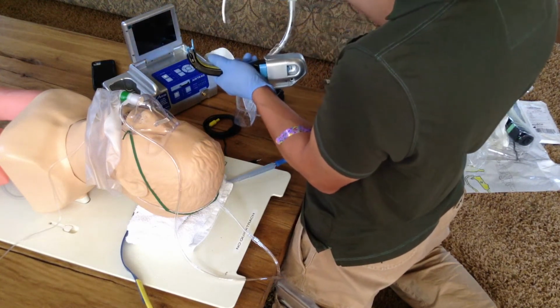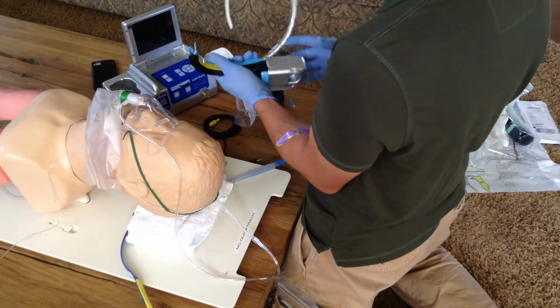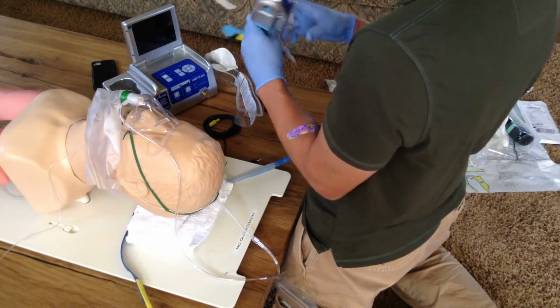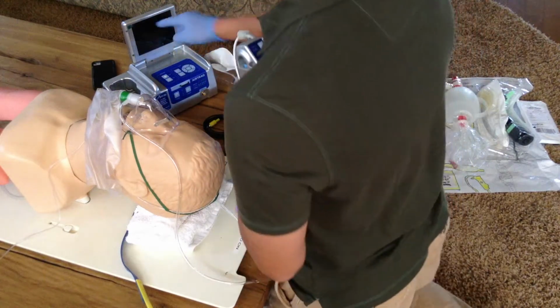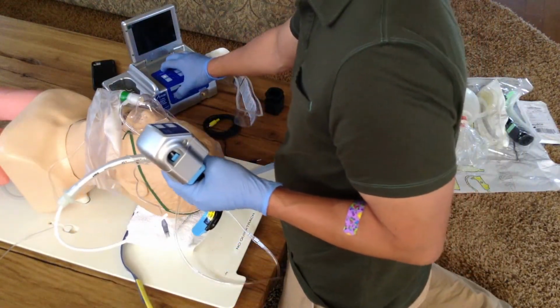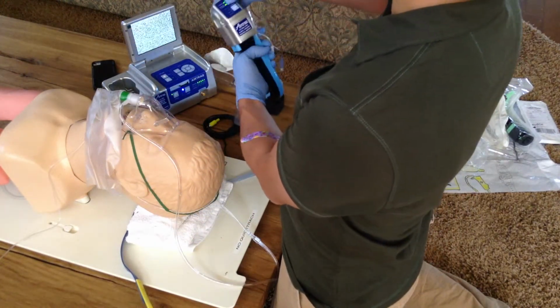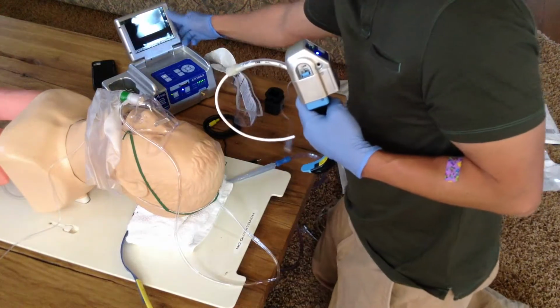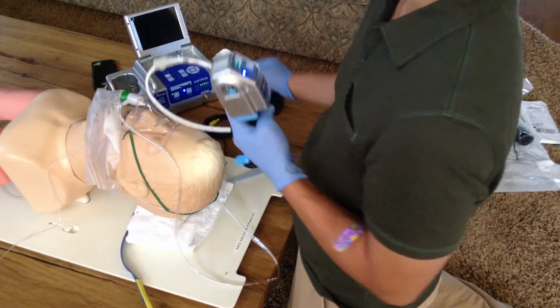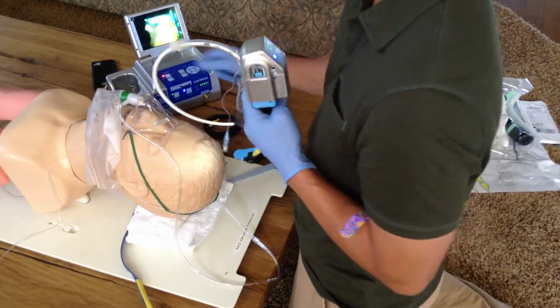And you'd also have to make sure that you've got a partner holding, or you're holding this as you're passing the tube there. So we got this part all set up, lubed, ready to go, and we've got the patient all ready. So basically we would turn on the power if we're using wireless, turn on our light, turn on this power here, and it should connect there. There we go. You can start the record button.